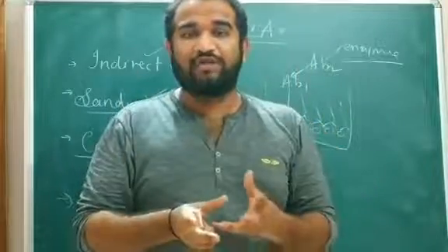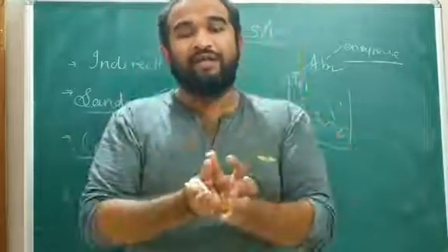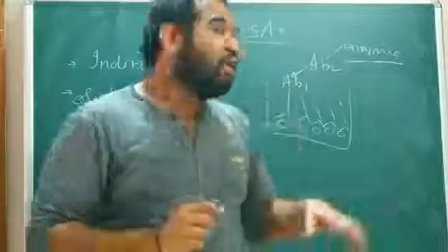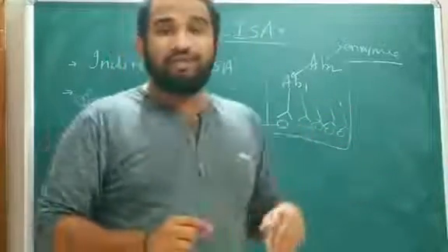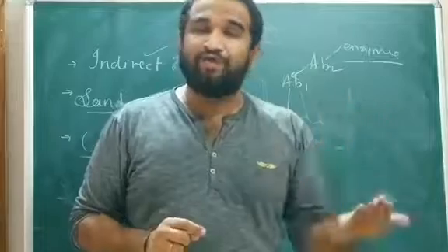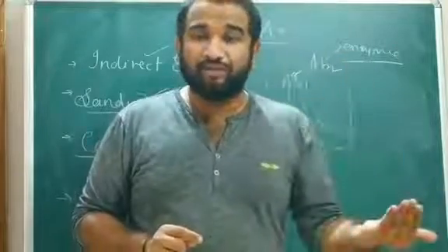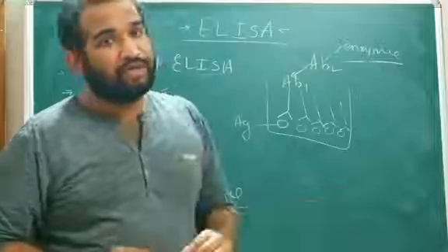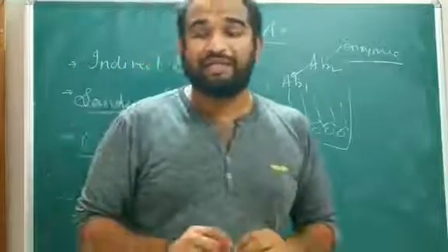Now, we all know the structure of the HIV virus. On the outer side it contains glycoproteins, oligosaccharides and polysaccharides. Against those glycoproteins and polysaccharides, the patient's body had produced the antibodies, and those antibodies have made a complex over here. So this is about the indirect ELISA.